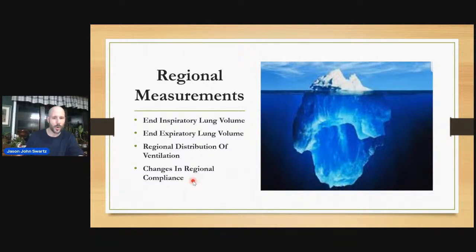Or if I'm in pressure control, the peak inspiratory pressure is a good starting point. Then you can do some titrating up and some titrating down. After, you press custom analysis, and the PulmoVista will give you the P high setting for your APRV that puts the lung in the most compliant region.